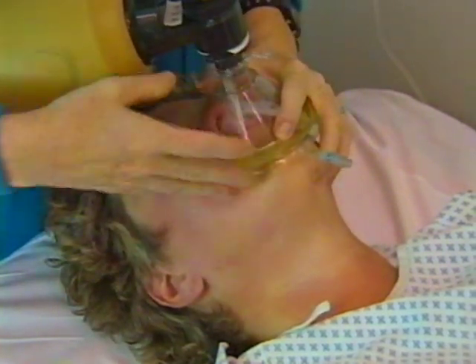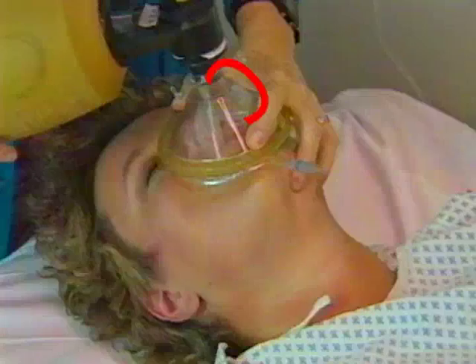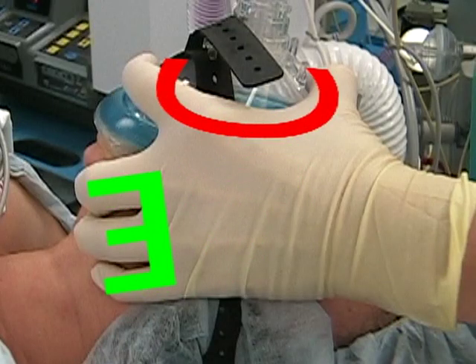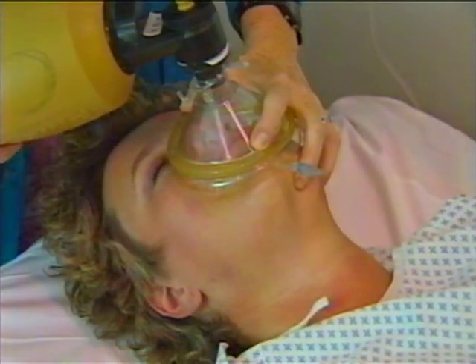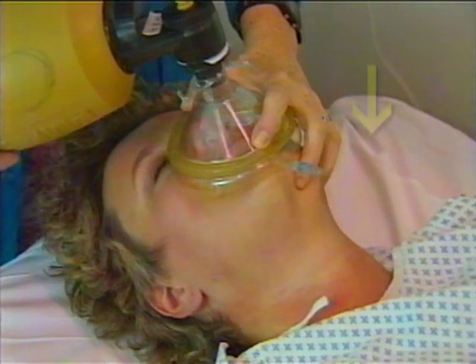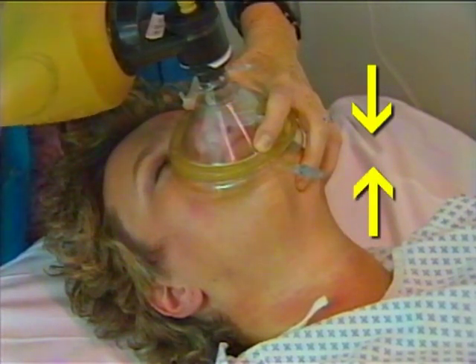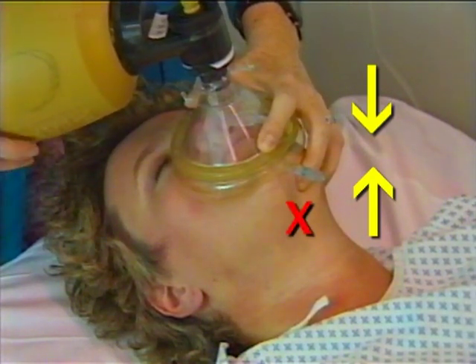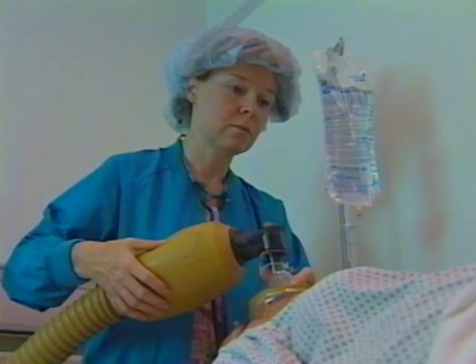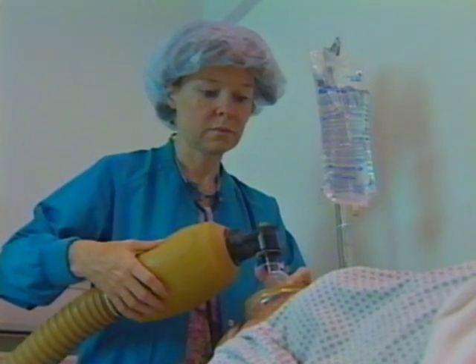The thumb and forefinger press the mask against the face and form a C shape. The remaining fingers grip the bony mandible, pull upward, forming an E. The mask seal is created by the opposing force of the thumb and index fingers pushing down against the force of the last three fingers pulling up on the bony mandible. Don't press on the soft tissue under the chin, because this can increase airway obstruction by pushing soft tissue down over the laryngeal outlet. Most people maintain the mask seal with the left hand and ventilate with the right, because the usually dominant right hand can do more of the physical part of squeezing the bag.